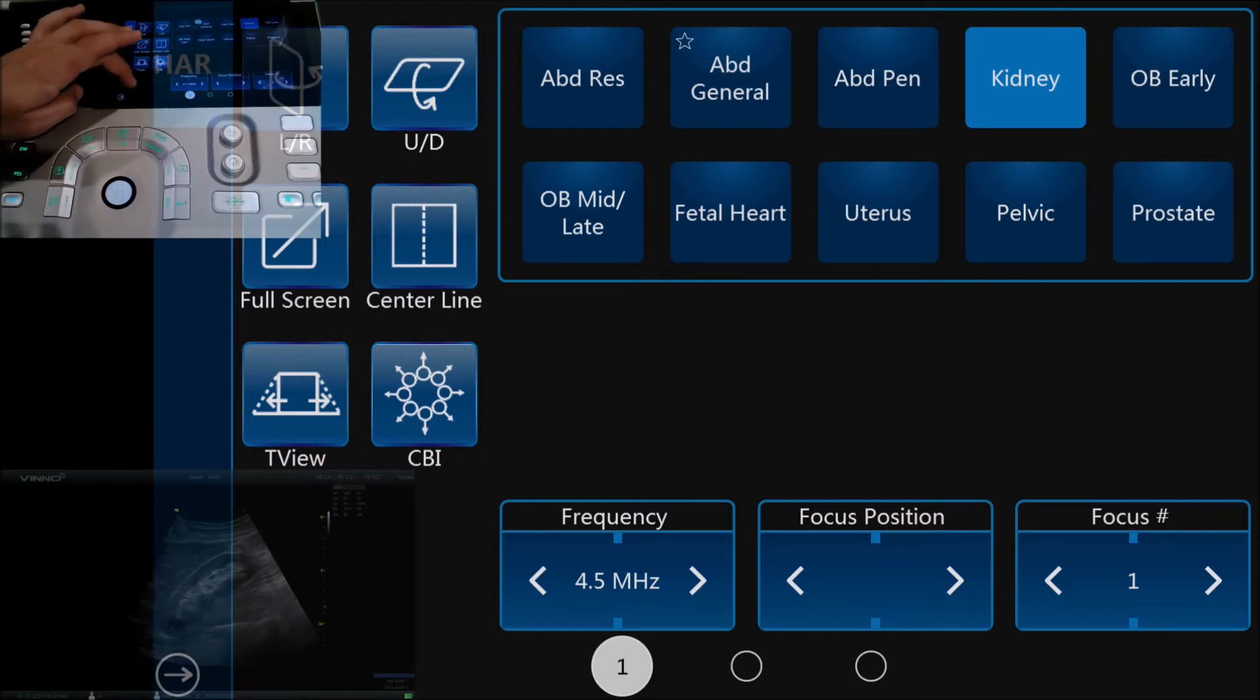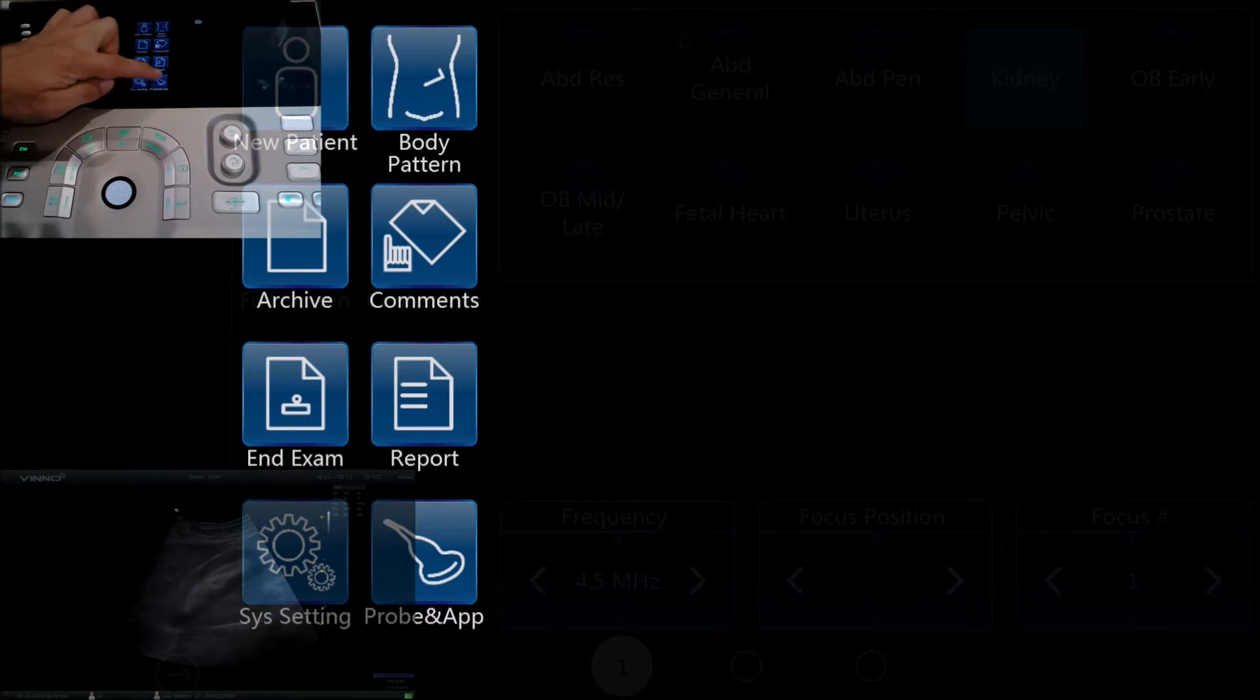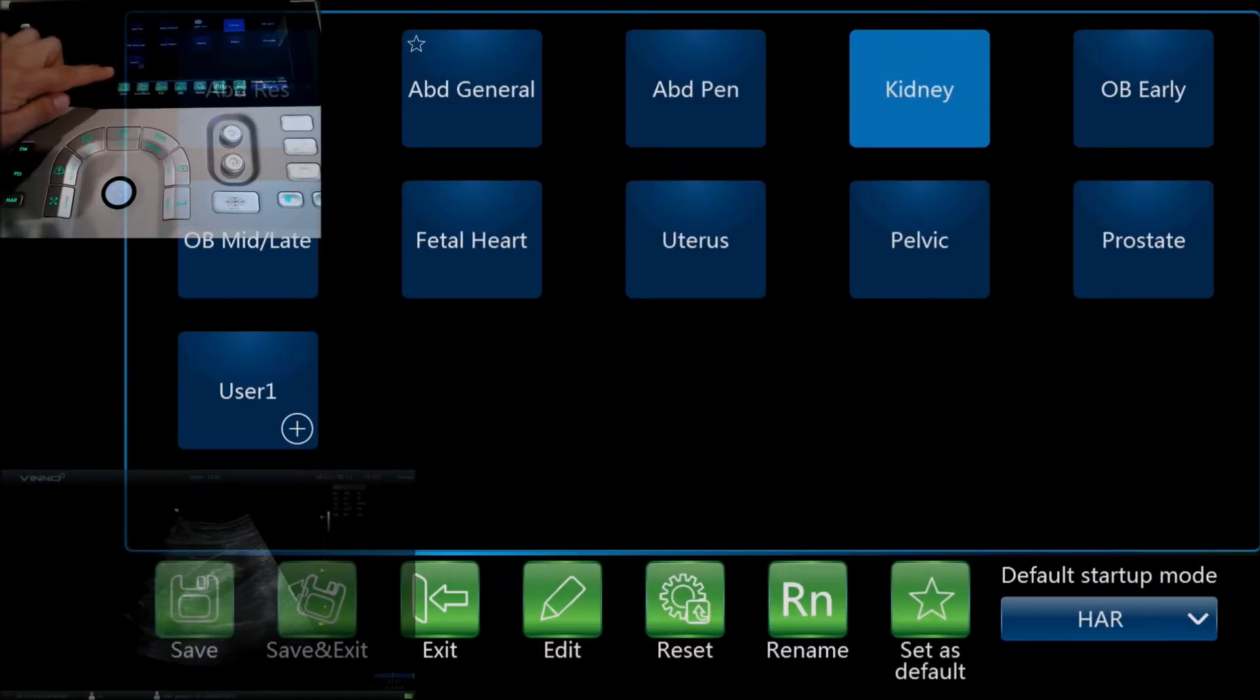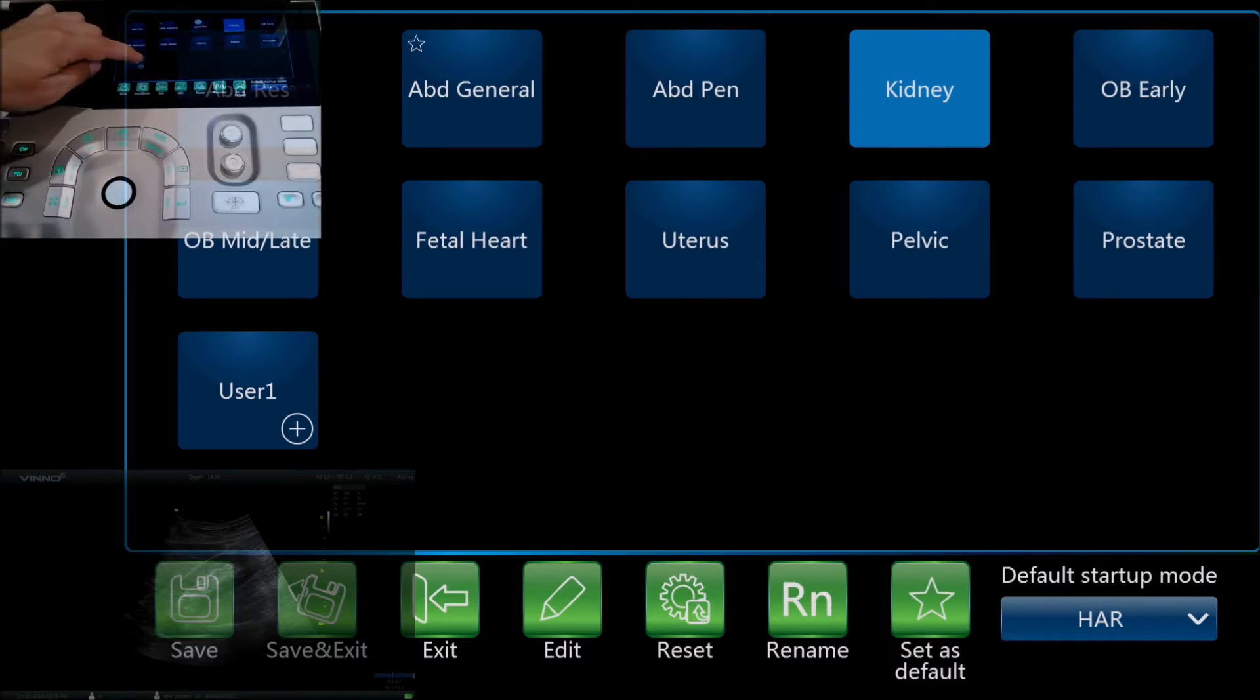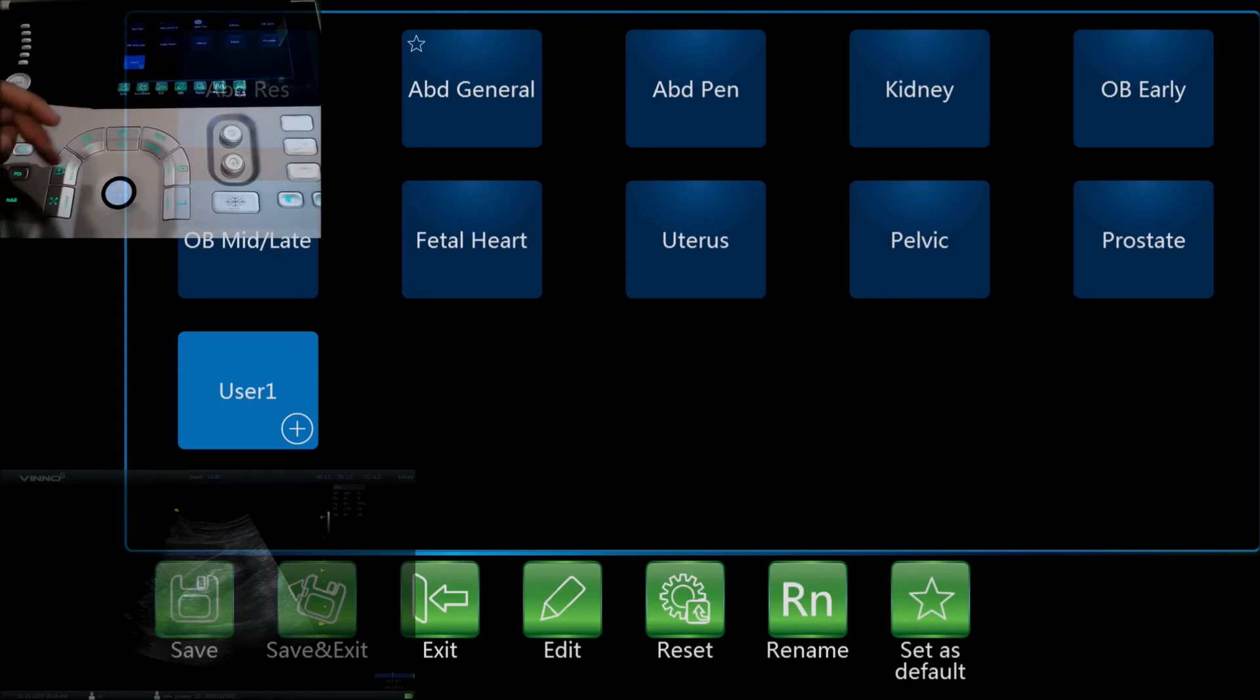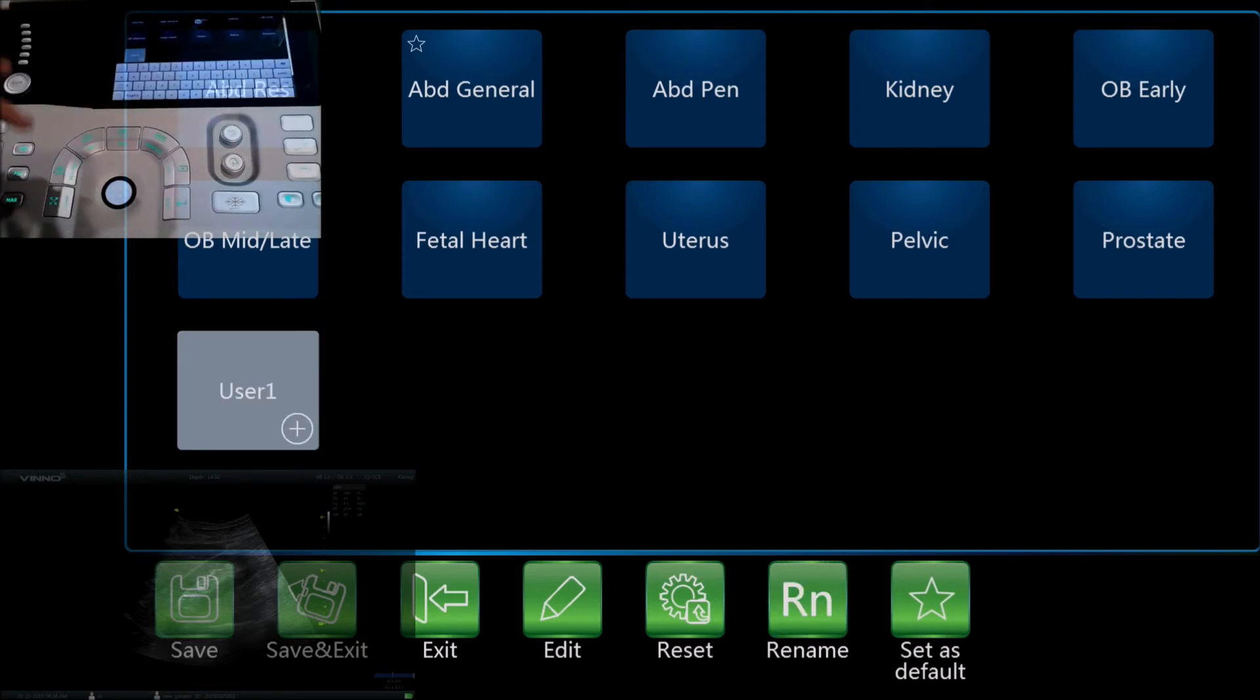Then you can go and save. If you want to, either save that to the new kidney preset or you can create as many user presets as you like. So you just rename this one as kidney 2, for example.